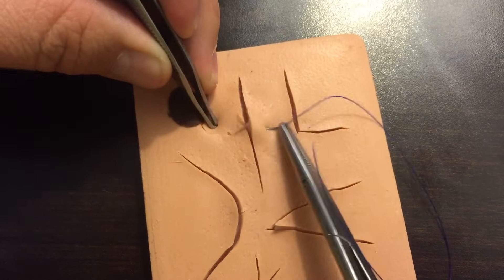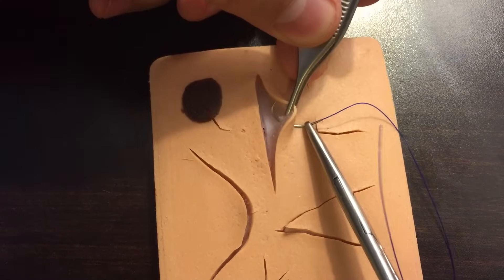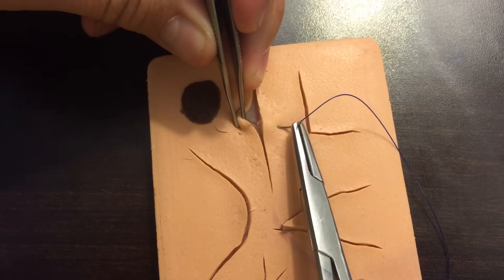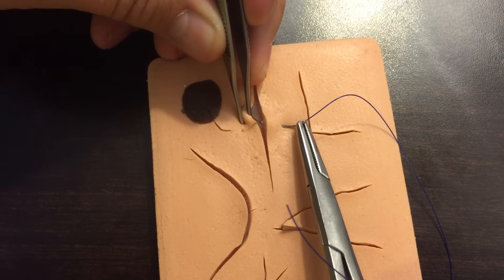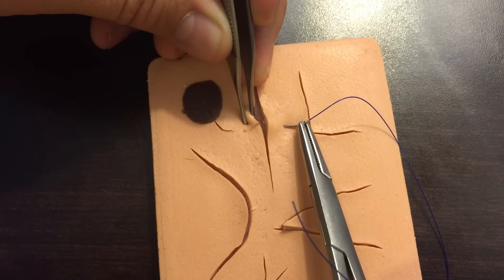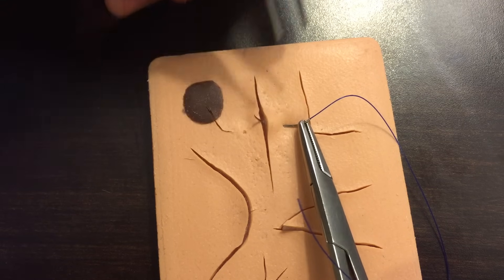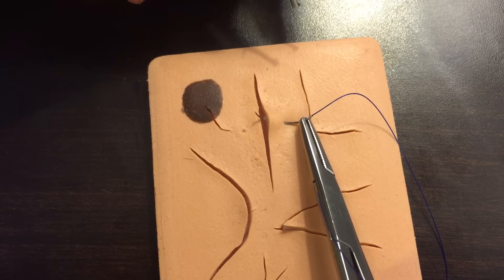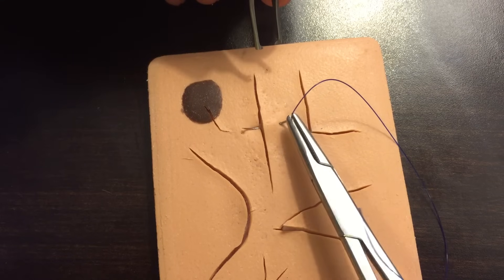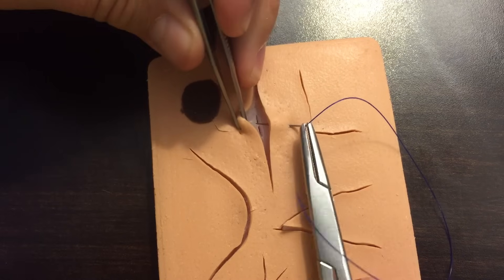You've got a good bite but you entered at 90 degrees — that 90-degree entry is potentially the most important part of simple suturing. If you don't get a good 90-degree bite, the skin edges will invert and the skin will not heal well. We need the skin edges to evert just a little bit, because in the fourth phase of healing — the remodeling phase — there's a lot of tension and pulling, and eversion of the superficial skin allows that healing and remodeling to take place without causing a buckling of the scar.